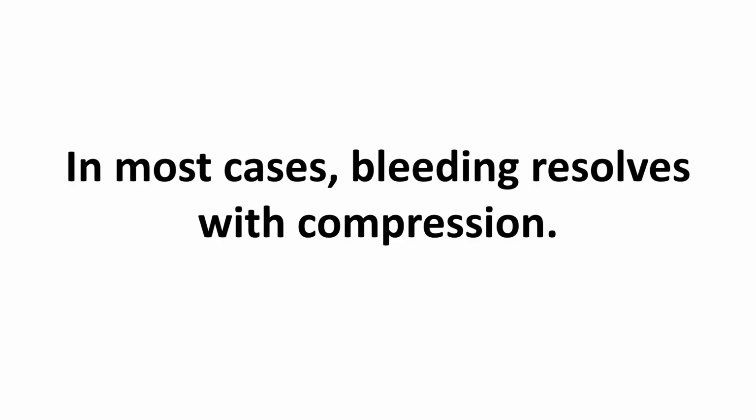Again, most cases resolve without significant problems if adequate compression is achieved, so it is crucial to determine whether bleeding has occurred.